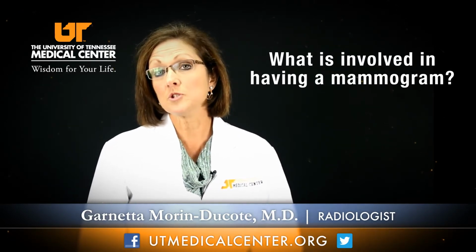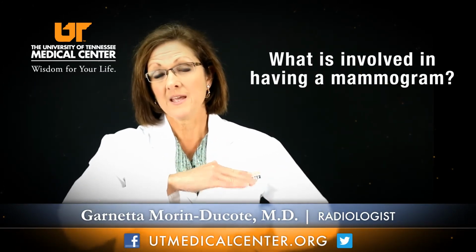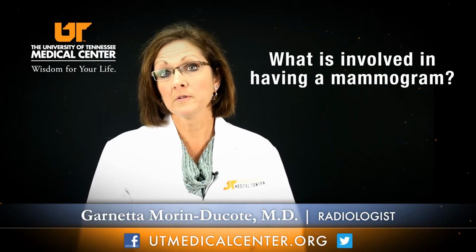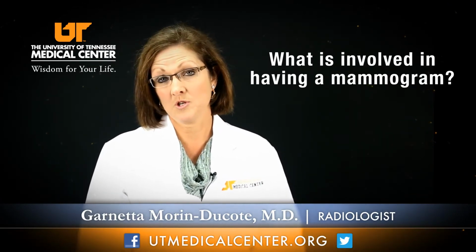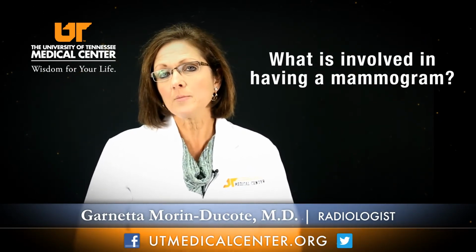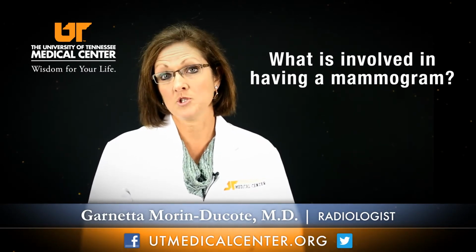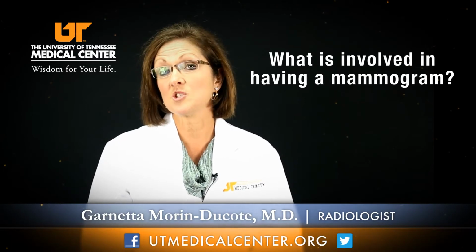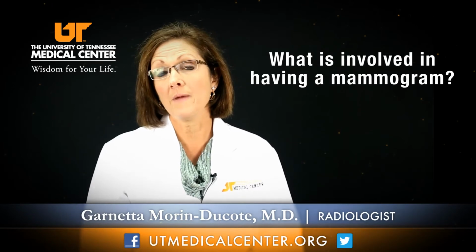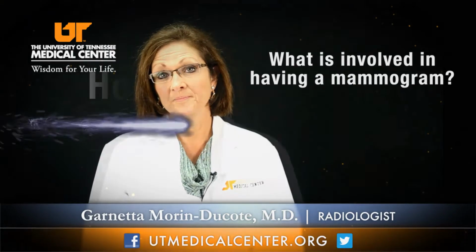So the breast is held in two different positions. One of them is to the side, one is from top to the bottom. It is light compression, the idea being just like a photograph, if you move, you blur the image, and therefore it degrades the image. So the patient needs to really be still, you hold your breath, you have that compression, and then the picture is taken. The technologist then looks at the image to make sure that it's okay. That's why she says she wants to check the image, because again, motion or contrast could make that image not acceptable. So that's called a digital mammogram.